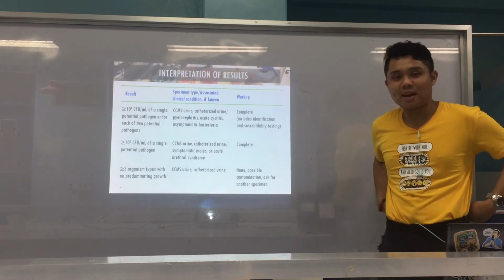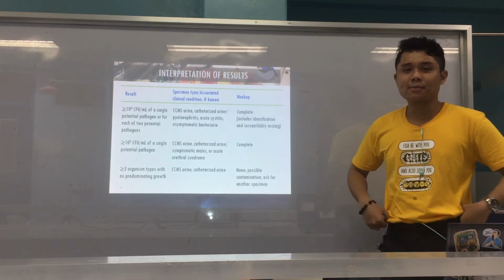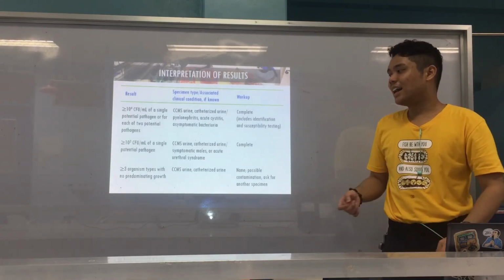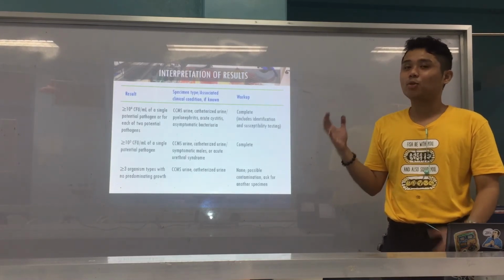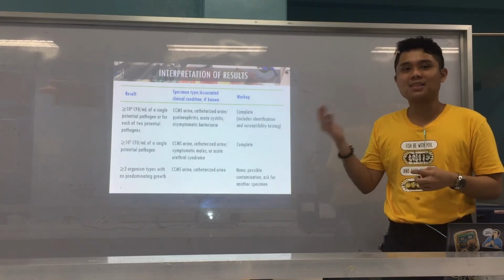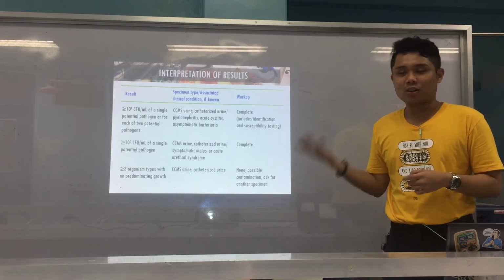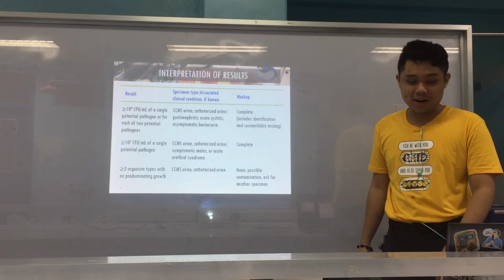Ask for another specimen. So you don't perform any workup on that, because again, 3 were isolated, greater than or equal to 3, and none of them has more growth, and none of them looks like a possible pathogen. So therefore, it could only mean that it's a contaminant. So ask for another specimen and don't perform any of the workup.